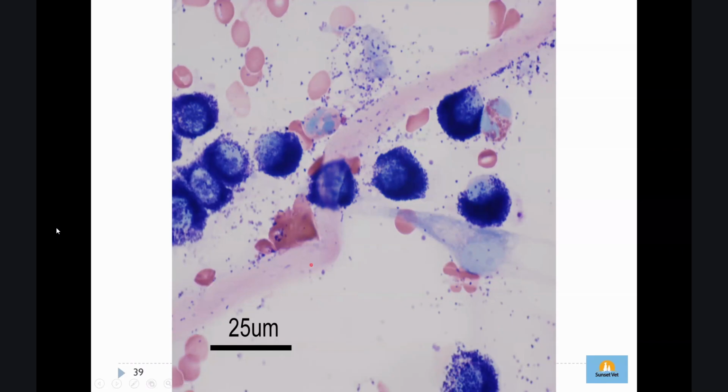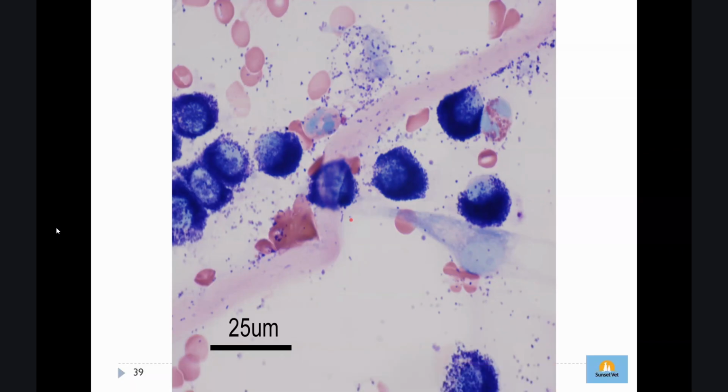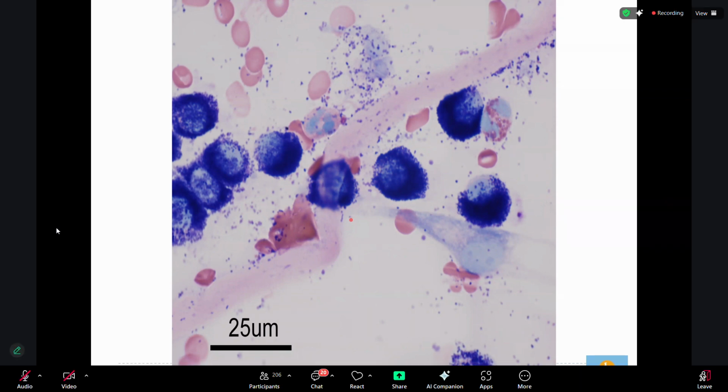You think it's like inflammation or cancer? Yeah, it's cancer. And then from the cancer, is it round, epithelial, or mesenchymal? Is it round? It's epithelial, more brown. Okay, round. Good. So from the round, do they have granules? Do they have any vacuoles? I think they have granules.